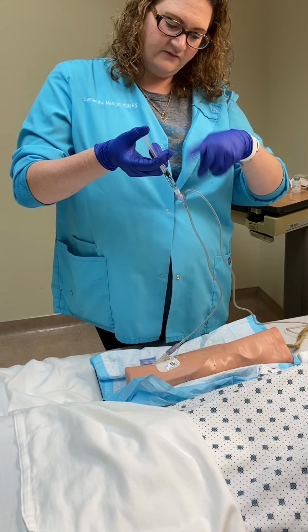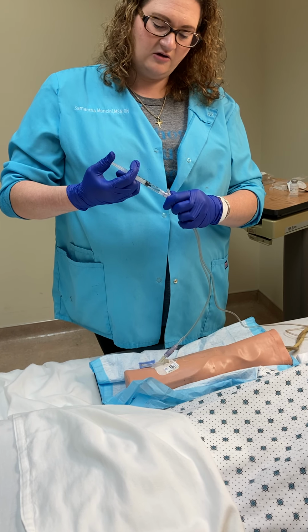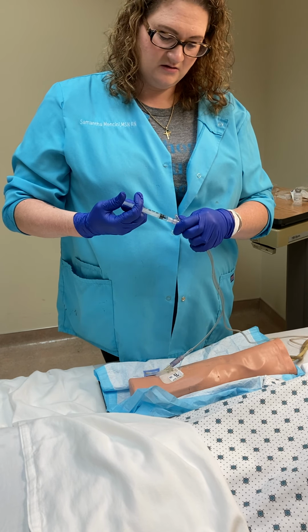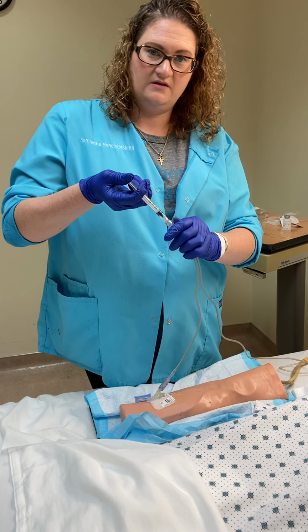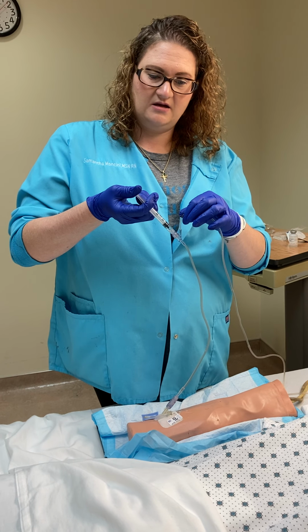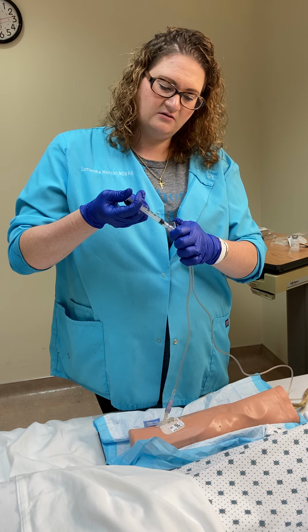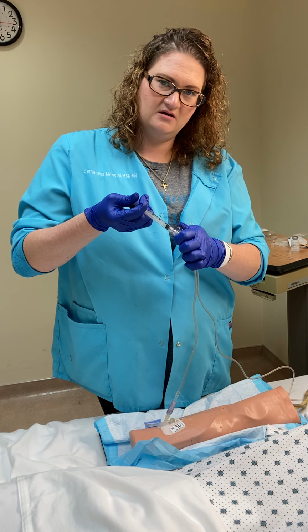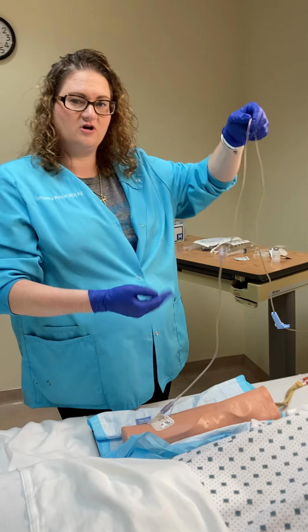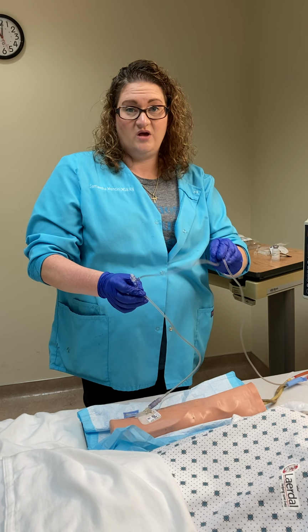And it's flowing through with the fluids now, so it's flushing in the med I just gave. And then I'll push another 0.5 ml over 15 seconds. And then I will release to let the fluids carry it in. And after that 15 seconds, I will do the last 0.5 ml over 15 seconds, and then allow the fluid to flush in. So I didn't need to flush before or after this because I'm using the line as my flush. That's good for compatibilities.